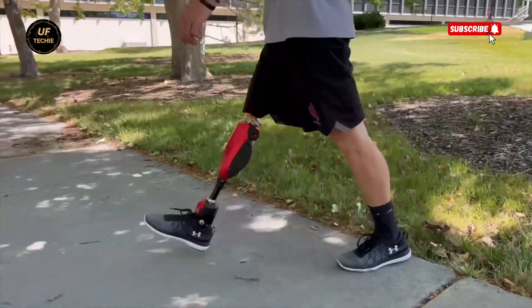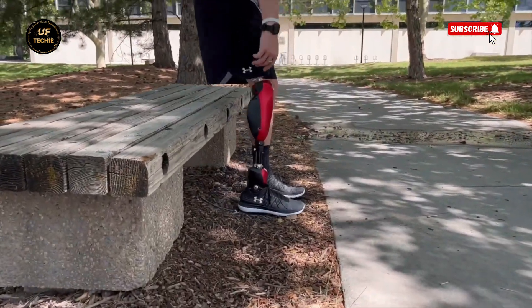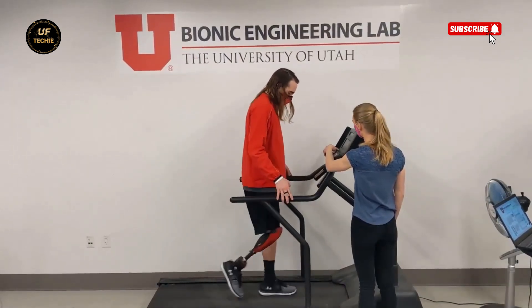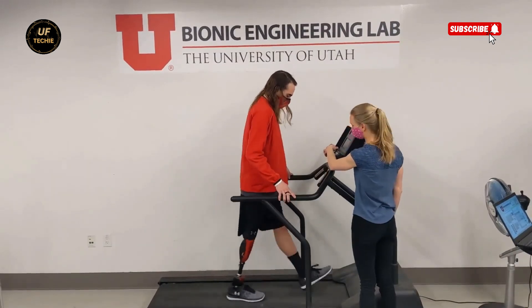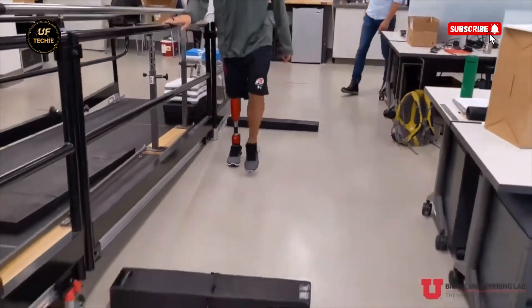Control doesn't end at the hardware. A dedicated mobile app allows users to fine-tune their walking settings, monitor residual battery life, and adapt the system to their personal preferences. This level of personalization ensures that each user can get the most out of their prosthesis based on their own body, activity level, and lifestyle.